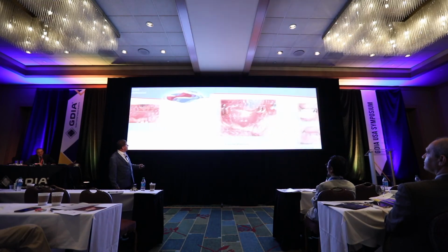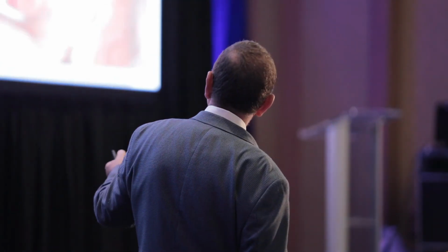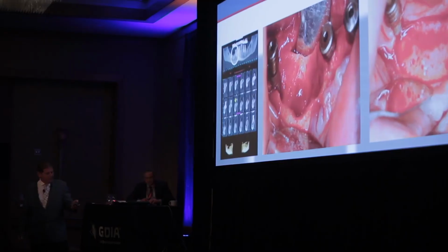Again, another case, I will run on it. Place the material, press, close for 3 seconds, close the flap, radiographic appearance. This looks disaster for those who are not familiar with this phenomenon. But at the re-entry, this is the patient on bone. And what you can see, that the big particles, like somebody shaped them because they resorb.